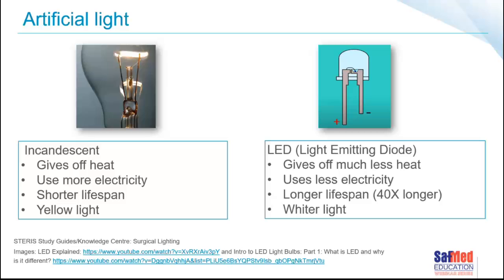So over the years in the operating room light environment, they used to apply various filters so that we could get clearer, more whiter light, because the natural light from those types of bulbs was in fact yellow.